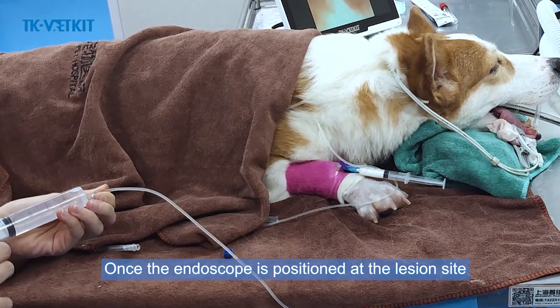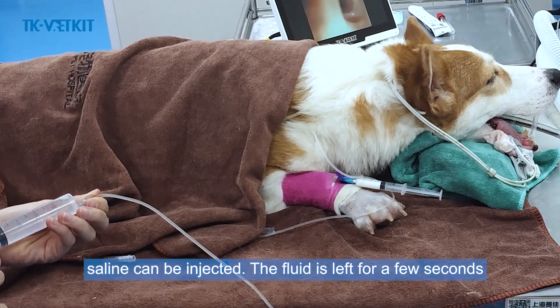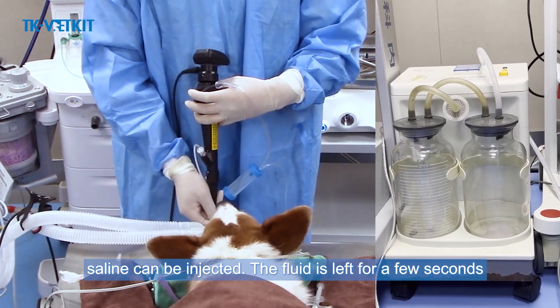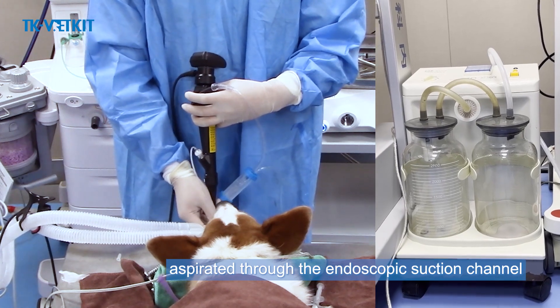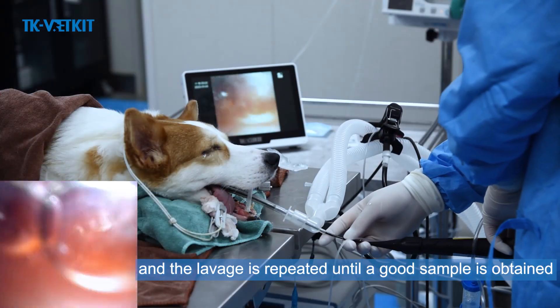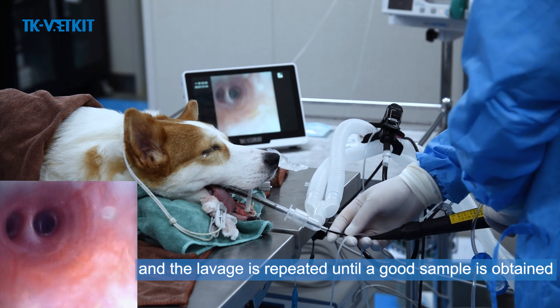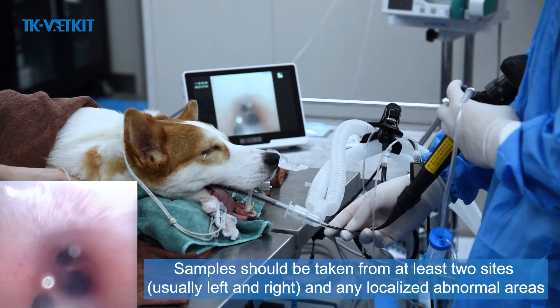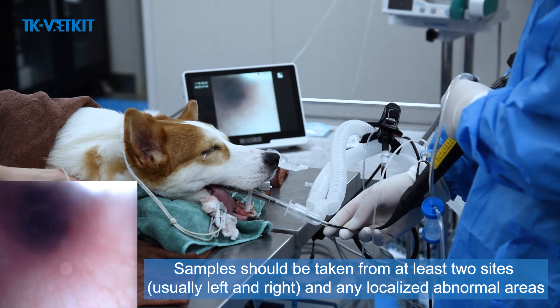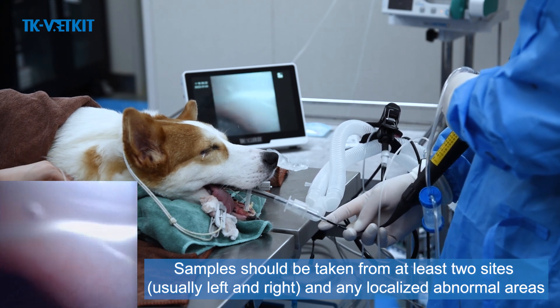Once the endoscope is positioned at the lesion site, saline is injected. The fluid is left for a few seconds, then aspirated through the endoscopic suction channel, and the lavage is repeated until a good sample is obtained. Samples should be taken from at least two sites, usually left and right, and any localized abnormal areas.